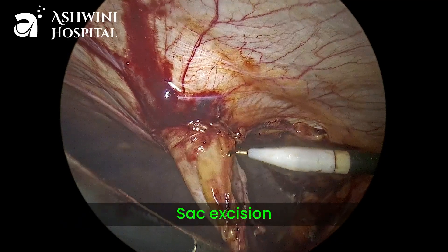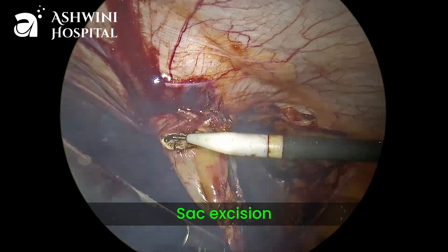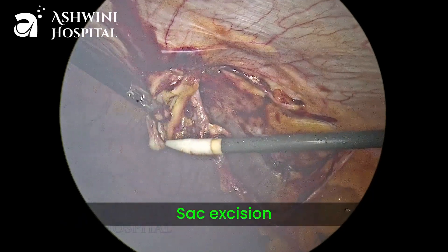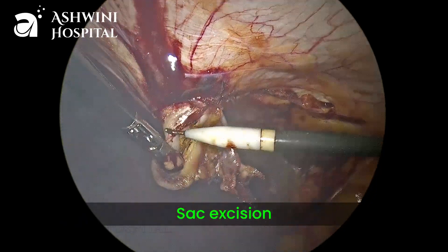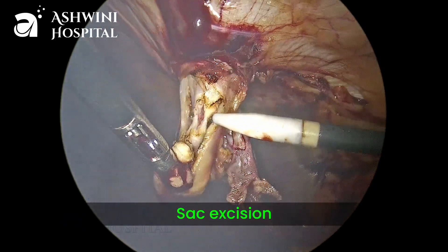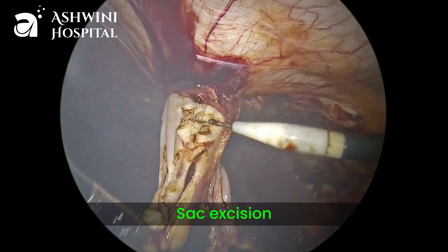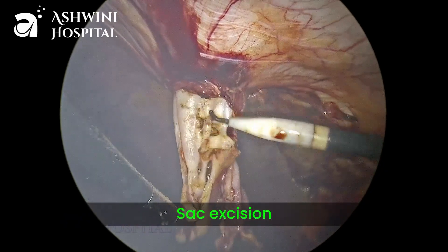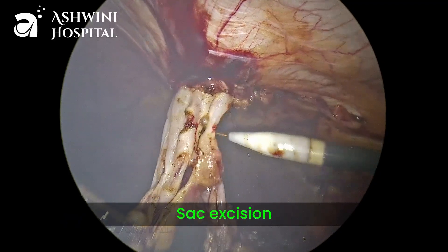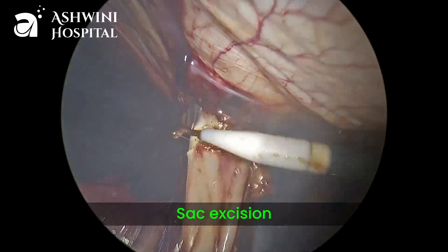You can observe a thick sac in this case because of the long-standing nature of the hernia. It is better to remove this kind of thick sac because if we keep it, there are high chances of postoperative seroma formation. By giving constant traction with the left hand and slowly releasing the sac adhesions using monopolar hook from the right hand port, the sac is slowly pulled out from the hernia.